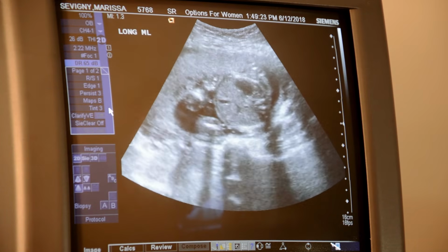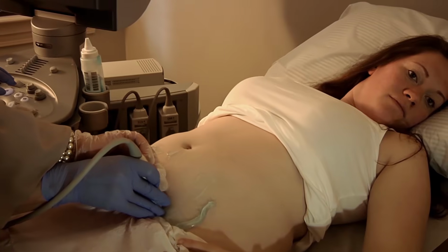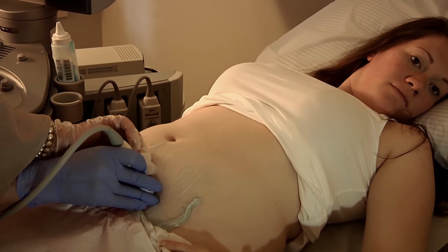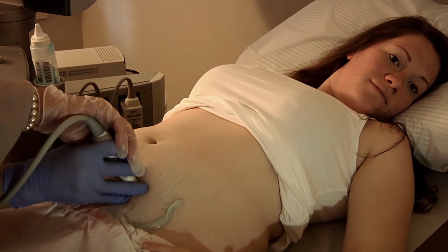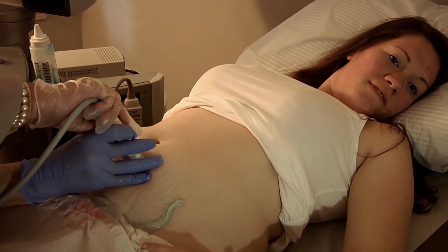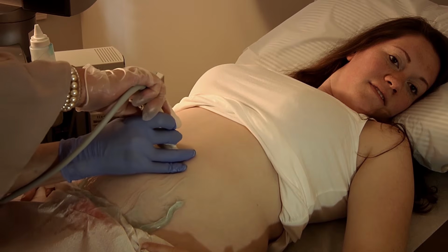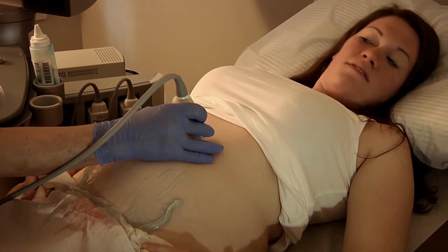And now she's going to ride the transducer superior, stand perpendicular, and keeping the transducer center to the abdomen until she's all the way out. And keep driving all the way out.